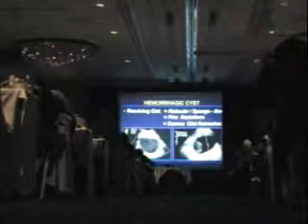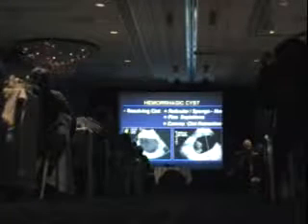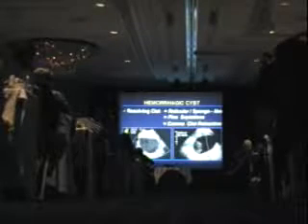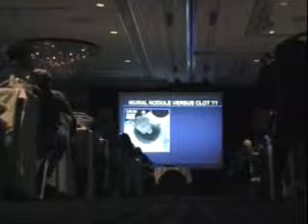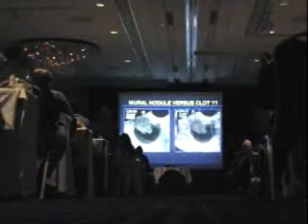Now, sometimes clot can retract and look a lot like a mural nodule. If you put color on here, there should be no flow, but I would be a little more concerned about this. Obviously, I'm going to follow both of these cases. Now here you look and say, well, I can't tell, is that a mural nodule versus clot? The first thing you should want to do is to turn on color, because if it's a mural nodule, it ought to have some flow. Well, there's no flow there.